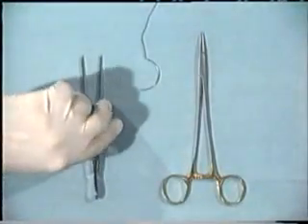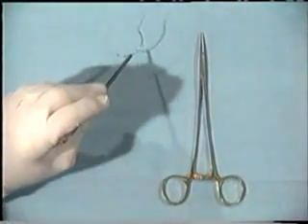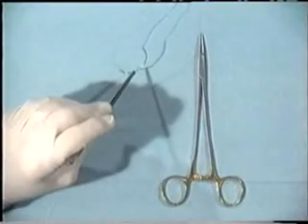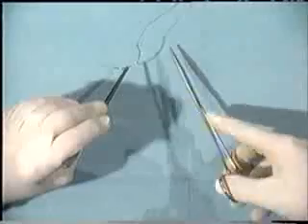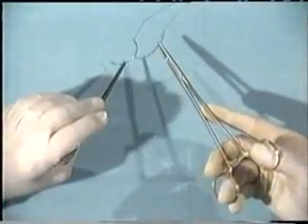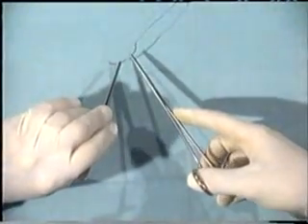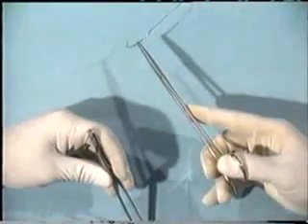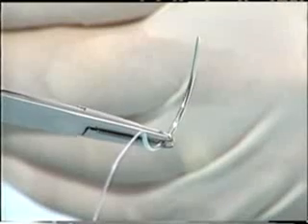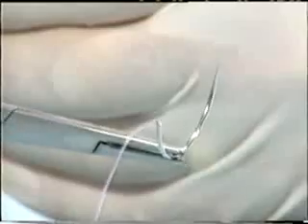Finally, we come to the needle holder. As mentioned previously, always pick up the needle with the forceps, then pick up the needle holder in a similar manner to the scissors and the hemostat. Place the needle holder about 2/3 of the way around the circumference of the needle, as you see here. Do not place it too near to the tip or the rear of the needle, and place it in the jaws of the needle holder as demonstrated.